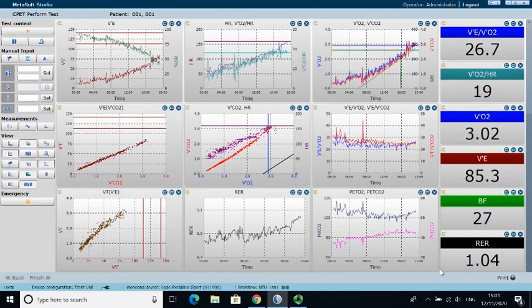And now during the test, this is the point where I'm focusing a little bit on the participant. It's important to look at the numbers, and I'm interested in it, but I'm also interested in them and making sure that I'm encouraging them to push themselves to get a really good test. The last thing you want is them getting a little bit distracted as they start to find it difficult. So it's really just about focusing on them, telling them that they're doing well and that they need to continue to push as hard as they can, and that there's probably only a few more minutes left, so just keep driving through, this sort of thing.